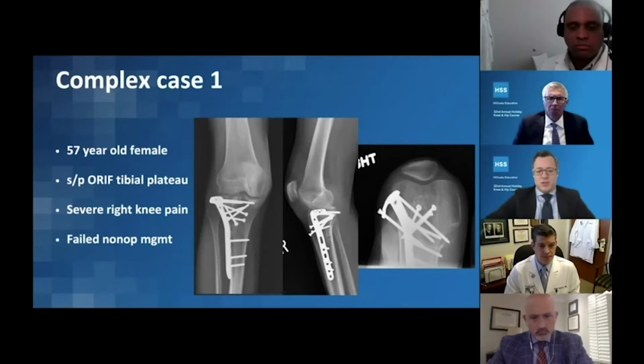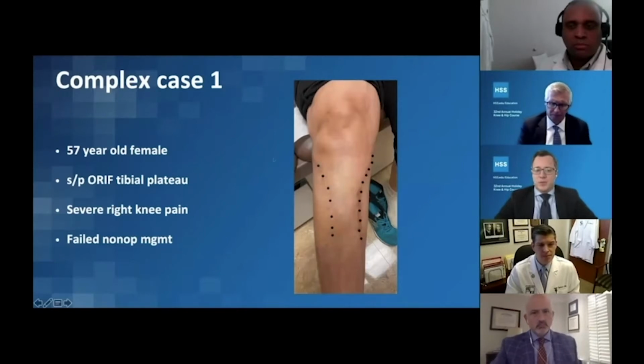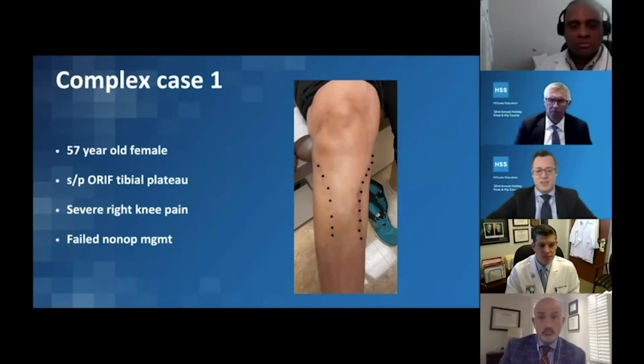George and I share a floor, so a thorough, exhaustive workup, like you guys can imagine. So she comes to us with these types of x-rays. She also has this skin incision. So 2 incisions, they went in there, they did the appropriate management. They didn't do the dead bone sandwich, which is what we usually see.